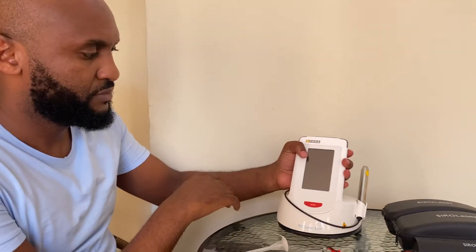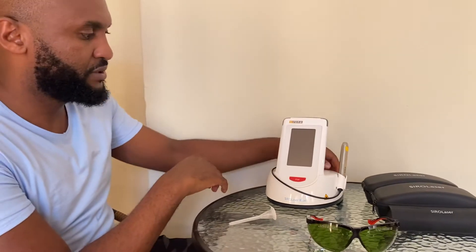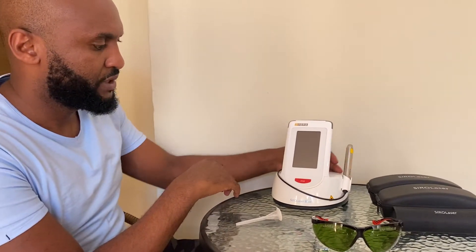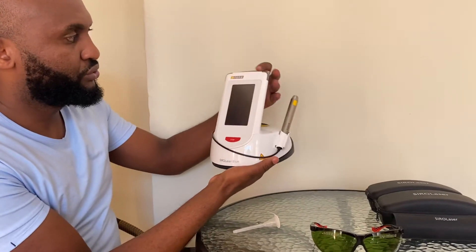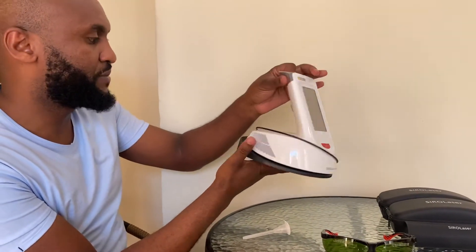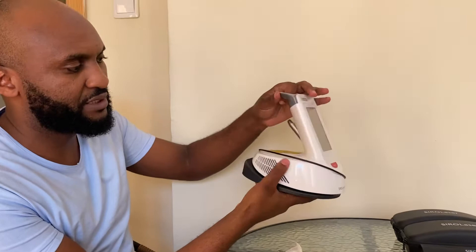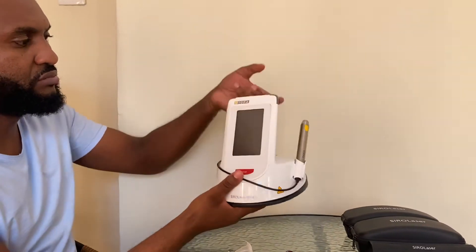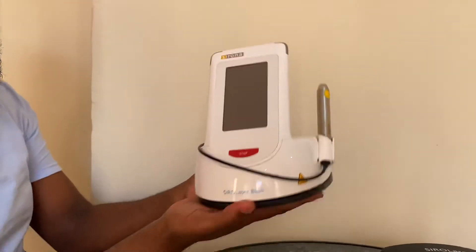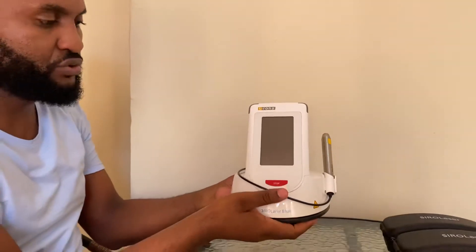Here is a soft tissue laser from the company Densplay Sirona. I'm going to demonstrate how to use the machine for ease of understanding. It's a very simple device, easy to hold. There's a handle there, and you can support it with your hands, which means the assistant can also hold it next to you.